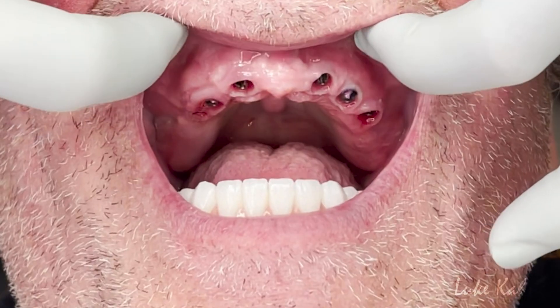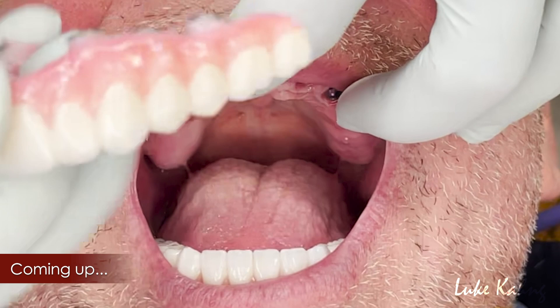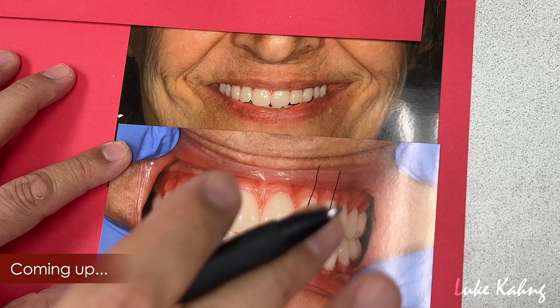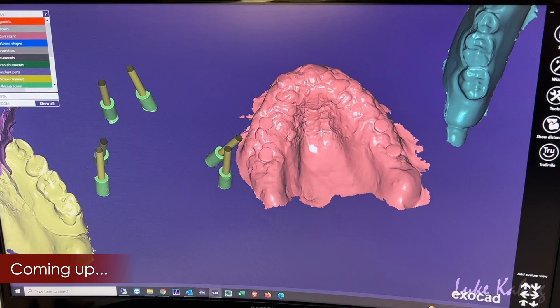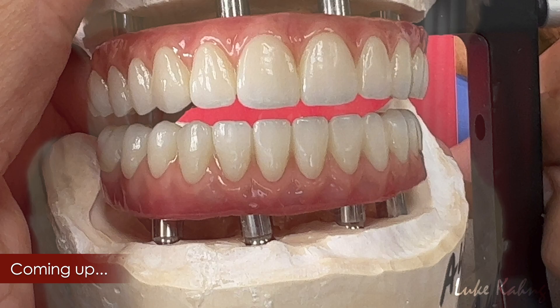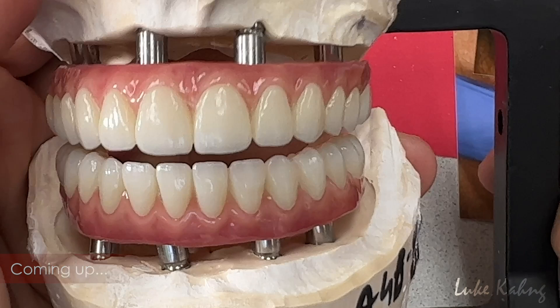In order to make the full mouth implant zirconia, usually patients have to stop by the dentist's office at least four times compared to two times. In this video we're going to illustrate how we made it in two times, cutting two visits for patient convenience. The patient came from out of state. The case is from Dr. Gerald Boyer and Dr. John Vargas — final cases mixed together, which are really lifelike full mouth zirconia restorations.